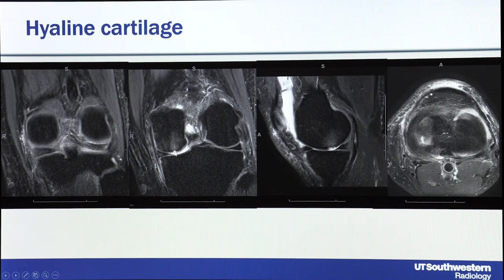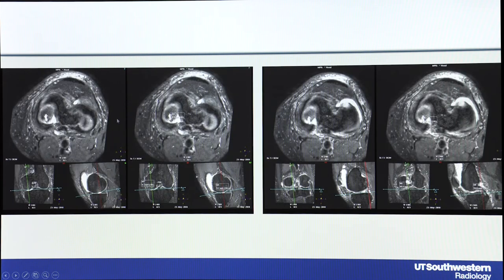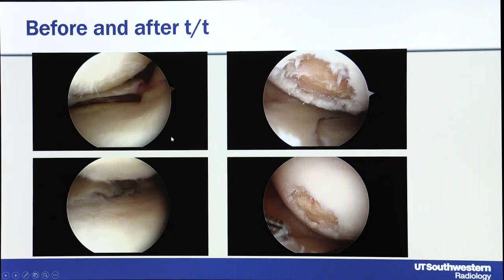You can also assess hyaline cartilage. Comparing 2D and 3D: on 2D there is a grade 4 defect with bone marrow edema; on 3D it's much sharper — a well-shouldered defect that is quite big with obtuse angles suggesting degeneration. Reconstructing in three planes allows measurement of the cartilage defect extent — the so-called puddle sign — and you can measure the defect.